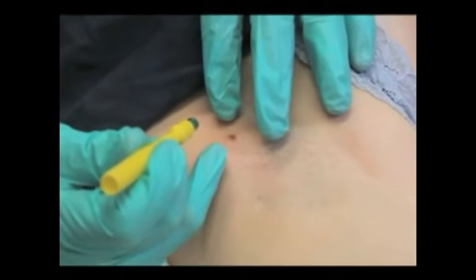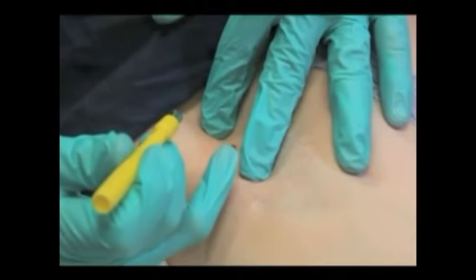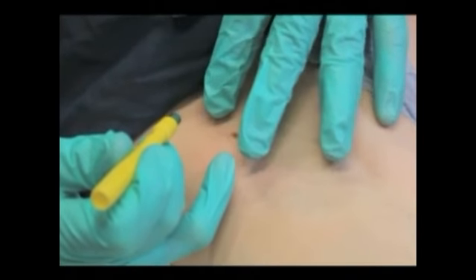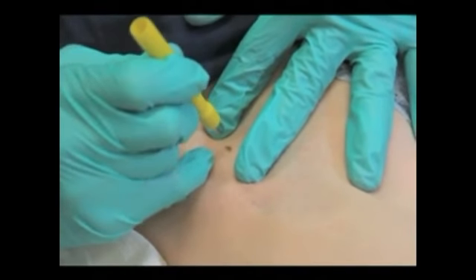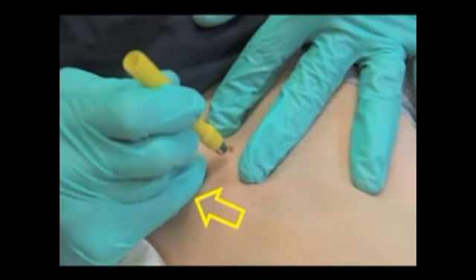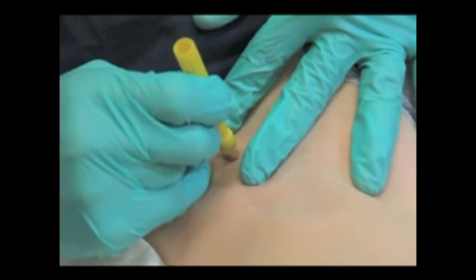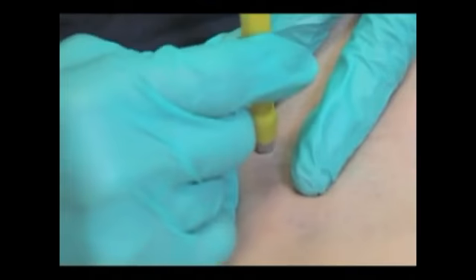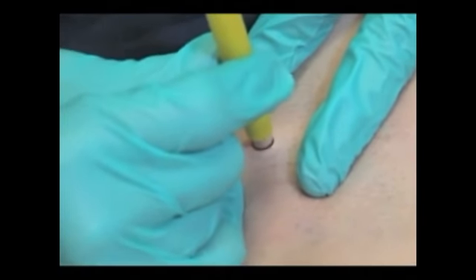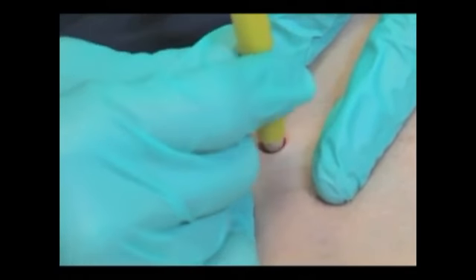Stretch the skin perpendicular to the skin tension lines. This results in an elliptical wound after the punch, which minimizes puckering once sutured. Hold the punch in your hand and place the fifth finger of that hand adjacent to the lesion for stability. Position the punch over the lesion. For pigmented lesions, use your imprint as a guide. Apply rotational and delicate downward pressure on the punch until you feel the give as it enters the fat layer.